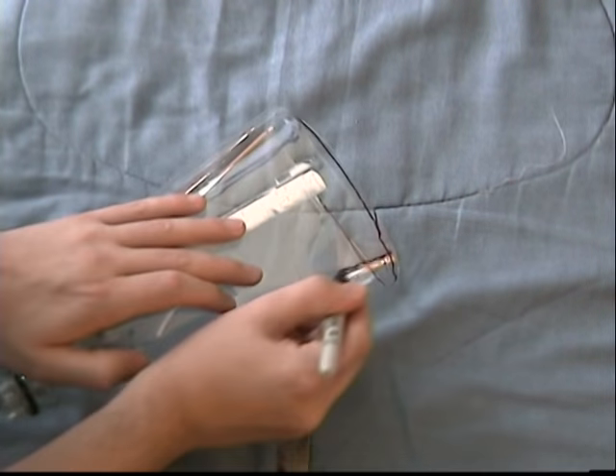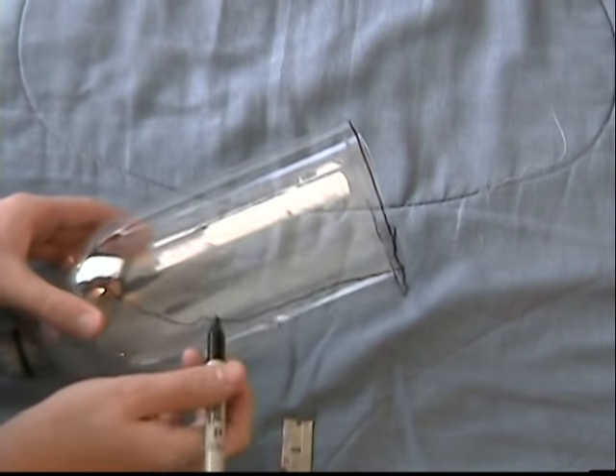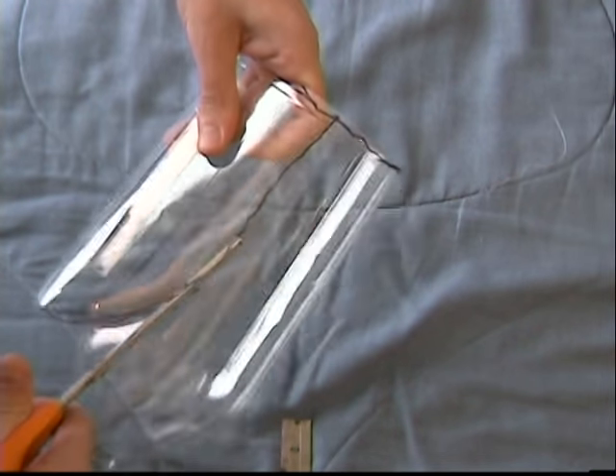Now for the face shape, draw it like so. Make sure the part you are cutting off is the side with the leftover glue on it. You can make corrections as needed.